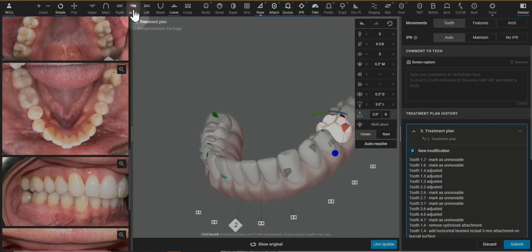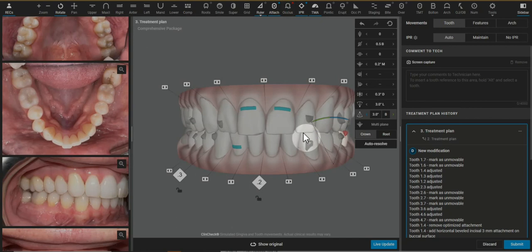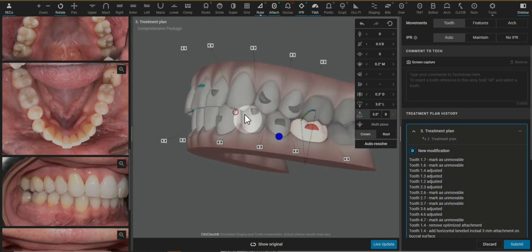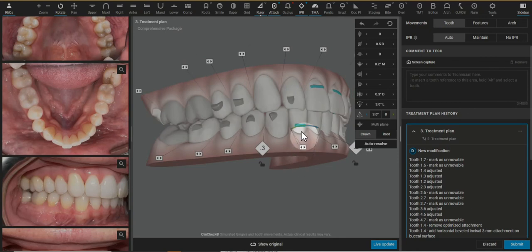I'm going to be addressing the premolar rotations and checking things throughout the rest of the case. But those are some of my initial edits and how I do them.